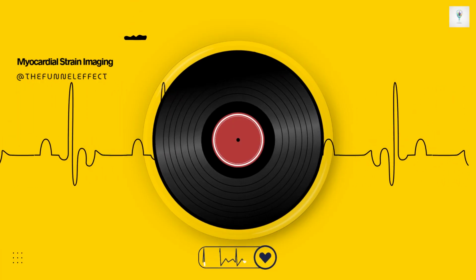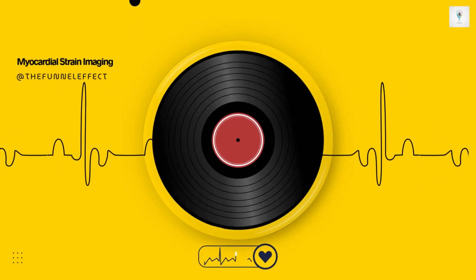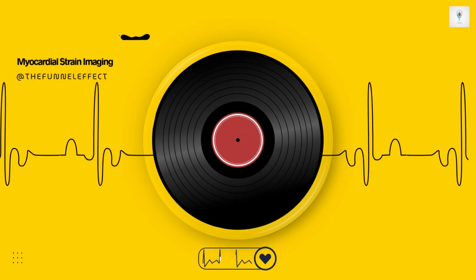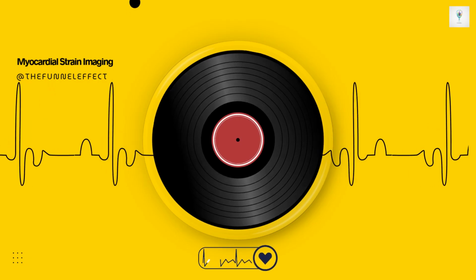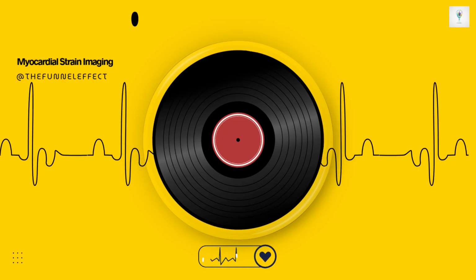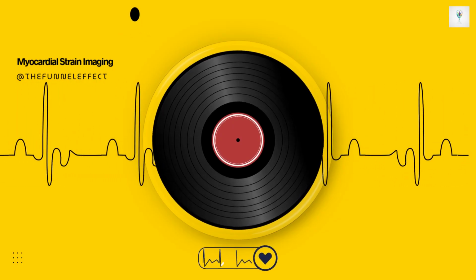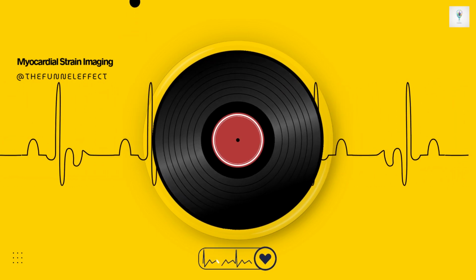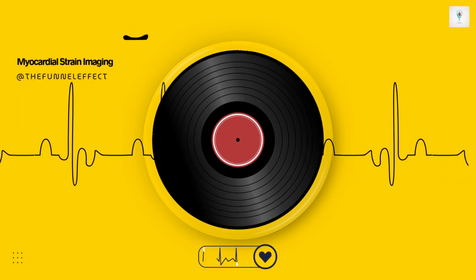I see. Now, the source mentions an alternative, the Eulerian description. You said that uses the deformed shape as the reference. How would that work? It's historically interesting because it was used when strain was calculated differently, by integrating strain rate. But clinically, it complicates interpretation quite a bit. How so? Well, using the Eulerian approach means your reference point is constantly shifting as the heart deforms. It's much clearer, much more robust to compare the contracted state back to that single maximal relaxed state. Lagrangian strain anchors everything to that fixed, reliable baseline. Makes comparing studies much easier.